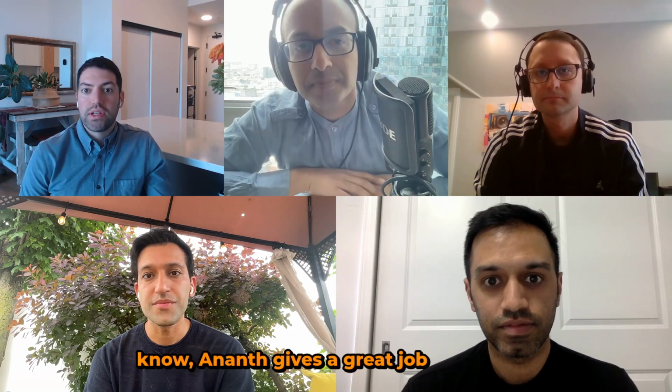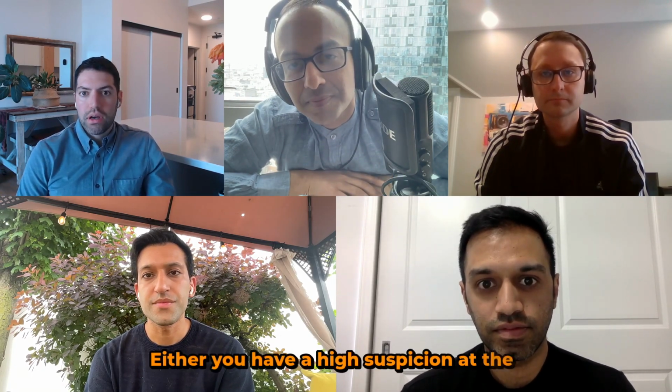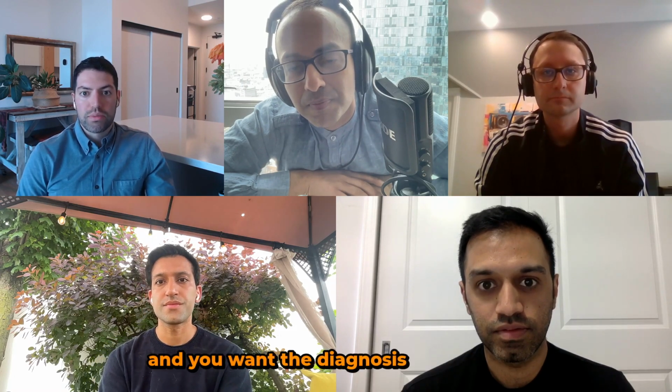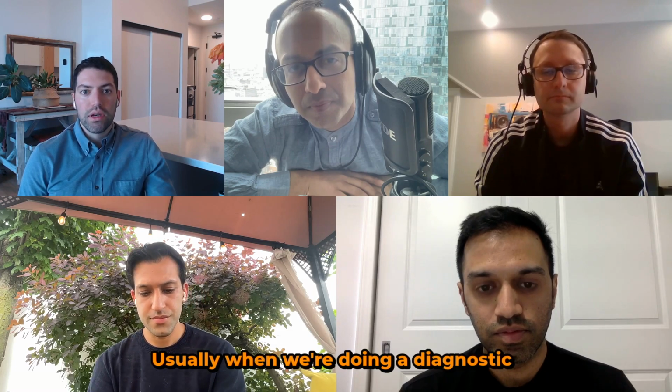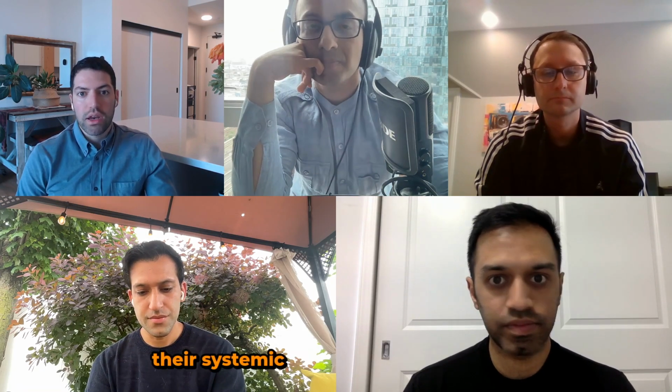Sure. So yeah, for part 2 here. Ananth does a great job of doing a diagnostic vitrectomy, but sometimes you need to do more. Either you have a high suspicion at the beginning of treating the patient that a diagnostic vit might not be enough, or maybe the patient's in really bad shape and you want the diagnosis as quickly as possible. Usually when we're doing a diagnostic vitrectomy, it's because we don't know what's going on. The patient's vision is getting worse, or maybe their systemic health is getting worse. So sometimes you have to go straight to the retina or subretinal space.